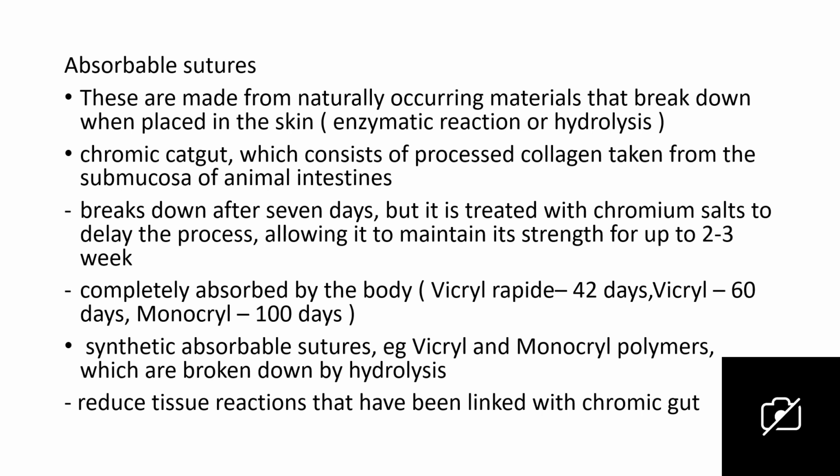The absorbable suture breaks down after 7 days, but it is treated with chromium salts to delay the process, allowing it to maintain its strength for up to 2 to 3 weeks. Like you said, it can break down, but because it's coated with the chromium salt, it prolongs its breakdown. Completely absorbed by the body. Example, Vicryl Rapide stays 42 days, and by 42 days it will be over, and there's just Vicryl only. It stays 60 days, Monocryl 100 days.